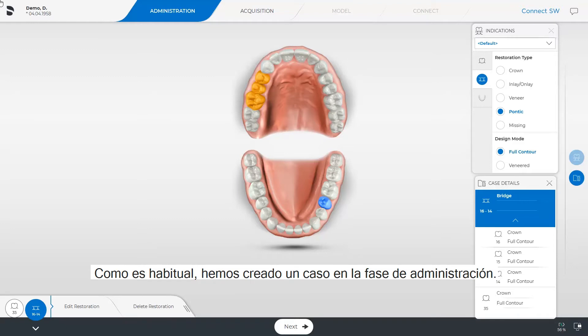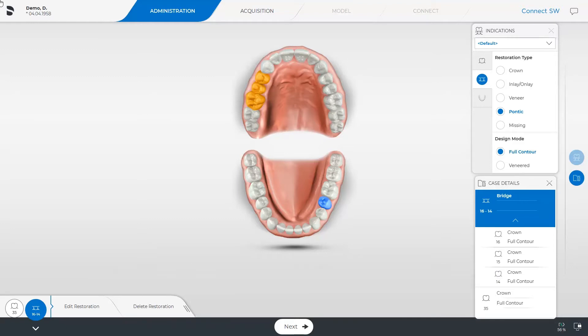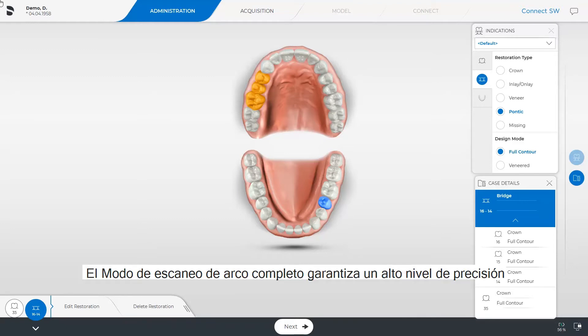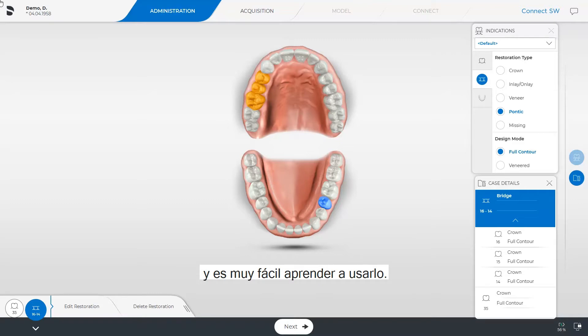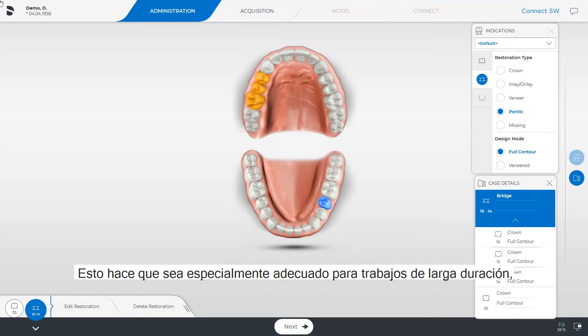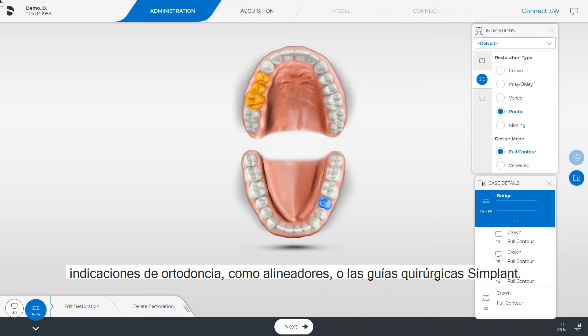We have created our case in the administration phase as usual. The full arch scan mode ensures a high level of precision for full arch scans with the Omnicam and is very easy to learn. This makes it especially suitable for long span jobs, orthodontic indications such as aligners, or Simplant surgical guides.